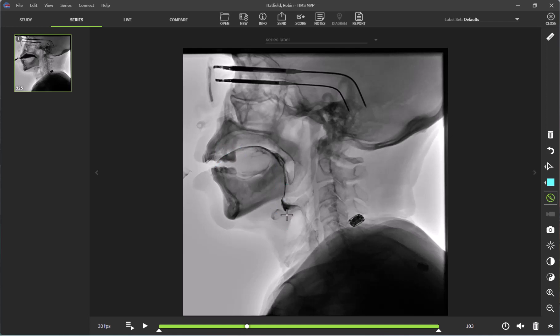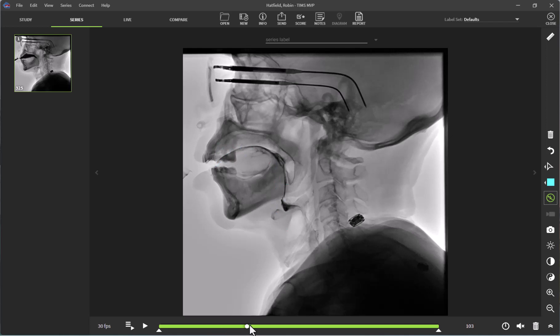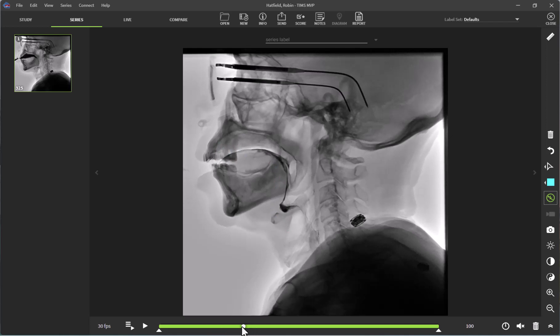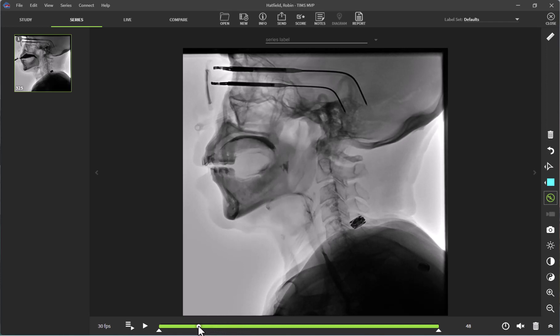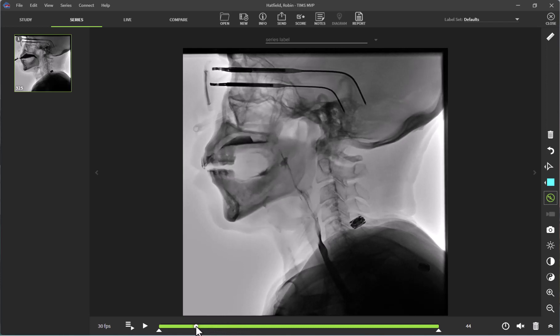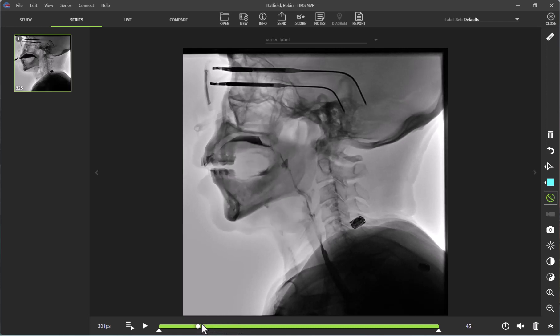To measure this, I am actually going to scrub backwards a little bit so that I can measure it when the residue is cohesive. You can conduct this measurement in whatever way is most efficient for you.